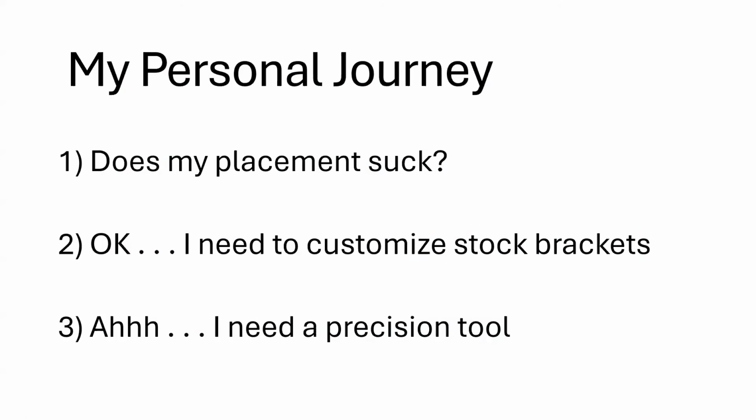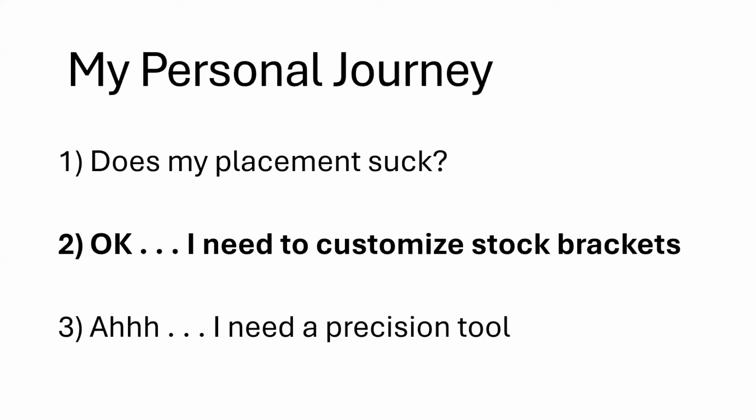Good. So first of all, that's what I tackled. I tackled my bracket placement. I'm like, okay, I'm going to get the best technology out there, and I'm going to have the most accurately placed brackets that I possibly can. But what was I finding? Man, I was still bending and detailing way too much. And I thought, okay, well, I need to start customizing these setups.